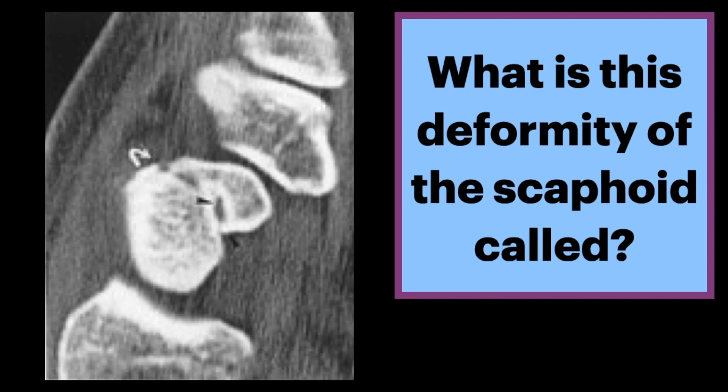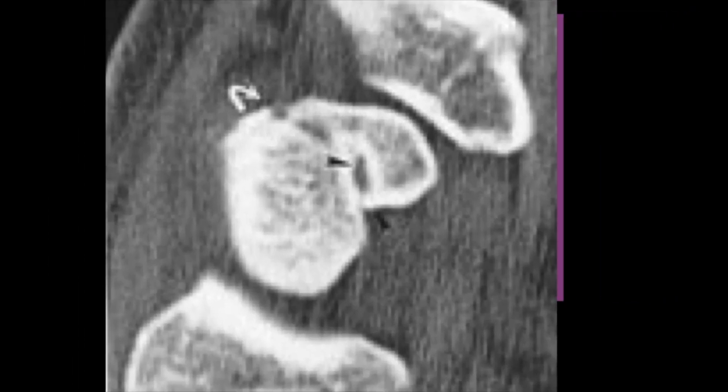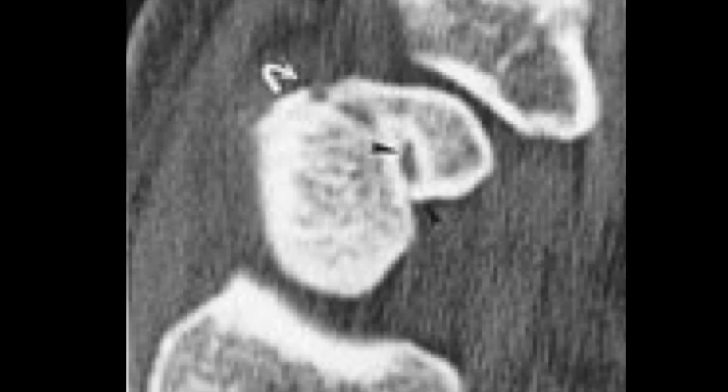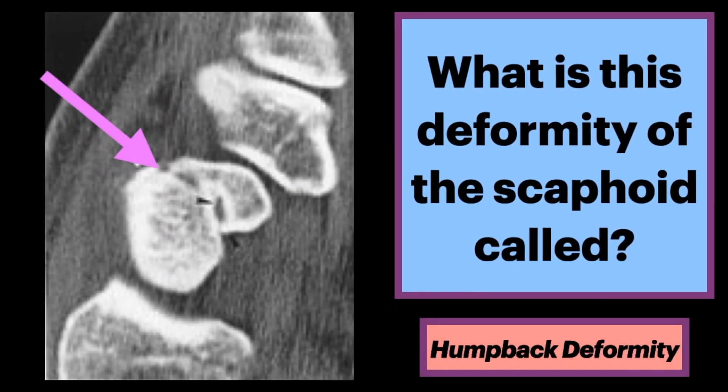What is this deformity of the scaphoid called? On this sagittal CT, note the fracture within the scaphoid waist and the folded configuration of the scaphoid. This is called a humpback deformity.